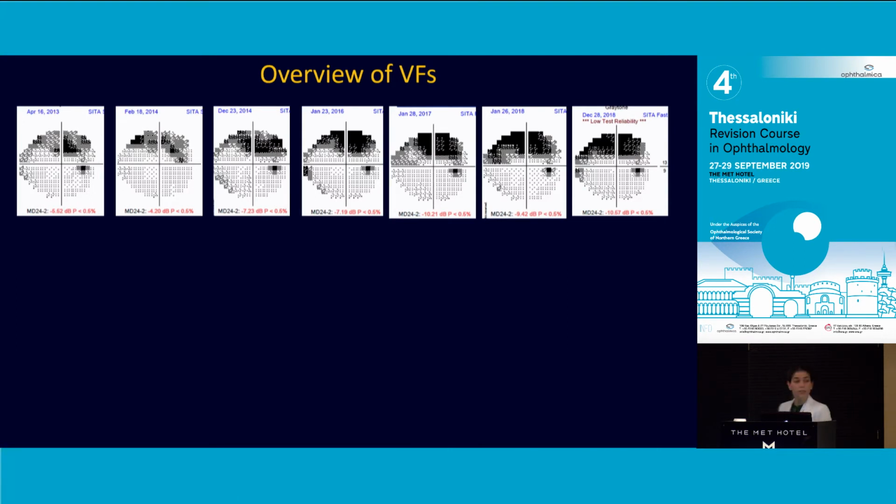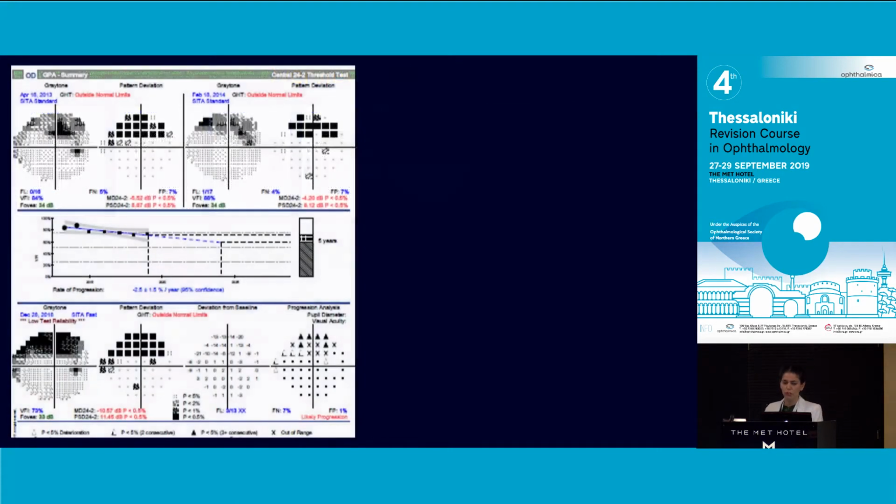She had the BRVO in 1998. No, I'm sorry, she had it before she came to us. So I thought, why would a BRVO defect be getting worse? Is it the scars expanding? Dr. Trenos, is that it? Could be. Yeah, I thought maybe that. But that's exactly what I thought, okay, here it makes sense to check the GPA analysis. So this is what I'm getting from the Humphrey.